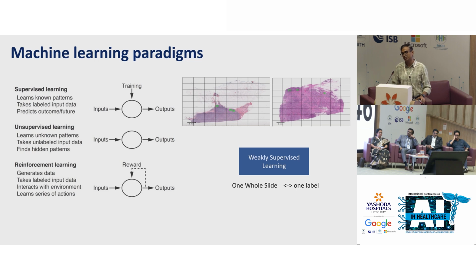With that information in hand, how can you build such models which could predict any of these outcomes that you are interested in? And one such framework that we adopted, because asking doctors to annotate those images is going to be one big challenge. The data sets that we curated are one aspect of it, but annotating those data sets for building a robust AI model is another gigantic task that we are faced with. So how do we deal with the availability of the data as well as the annotation that comes with the data?